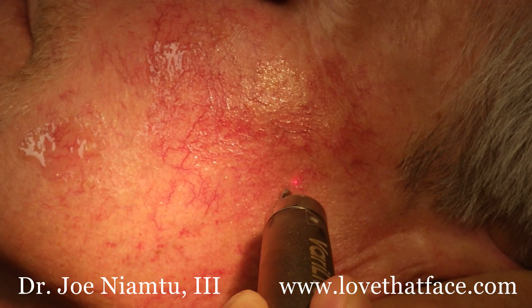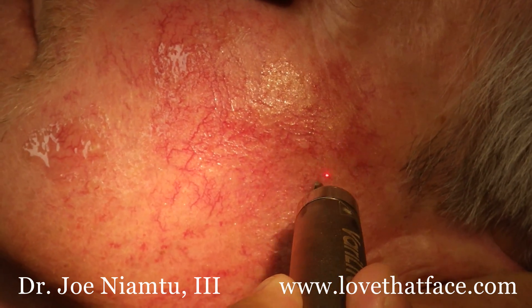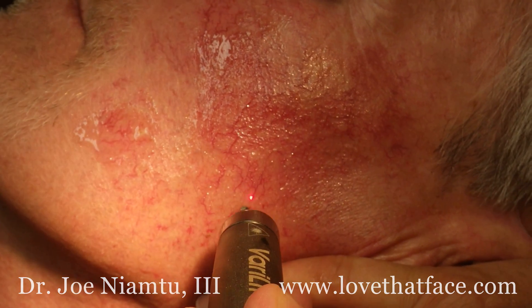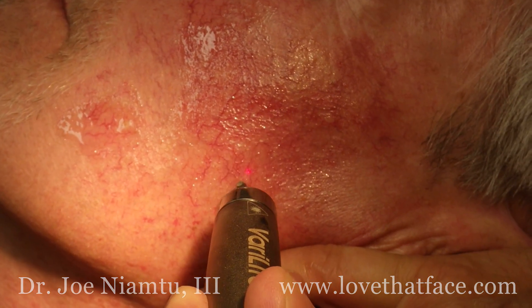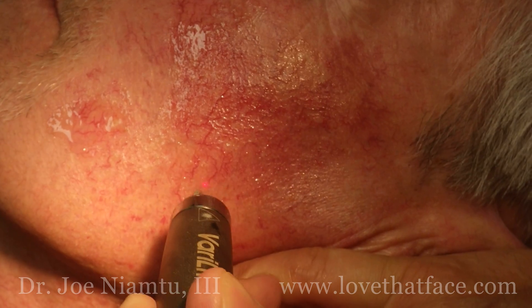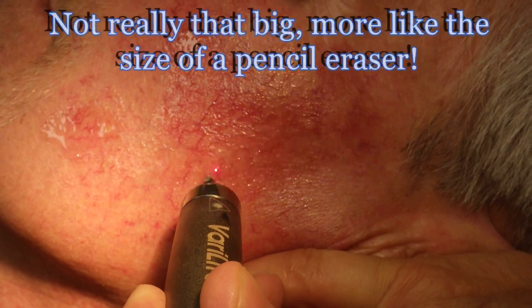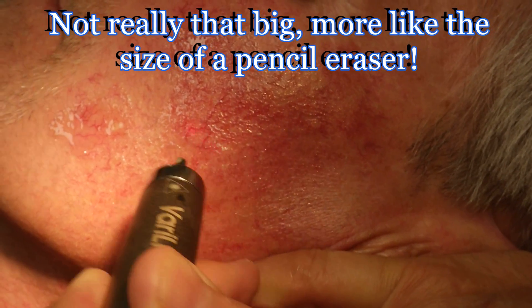Some patients will respond to a single treatment, and other patients will need maintenance or multiple procedures. The old-fashioned lasers used to leave purpura, or black and blue marks, and they're about the size of a Volkswagen.